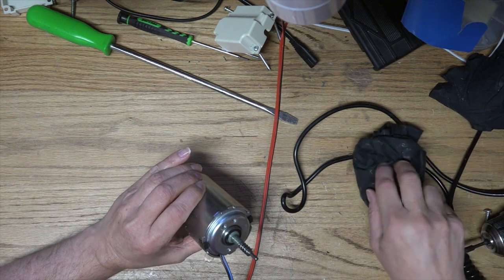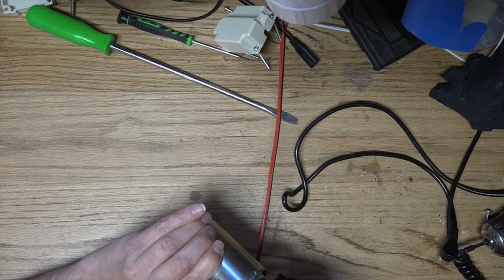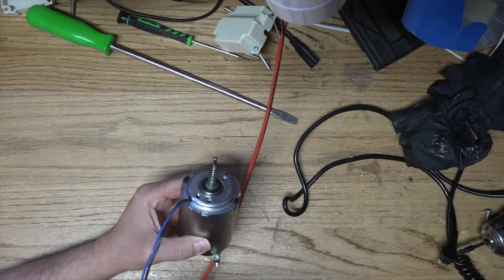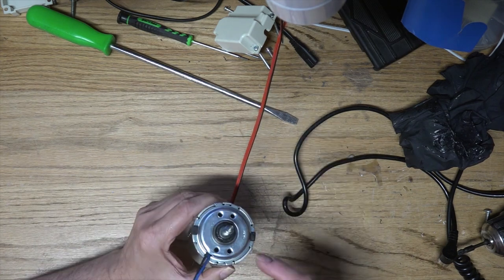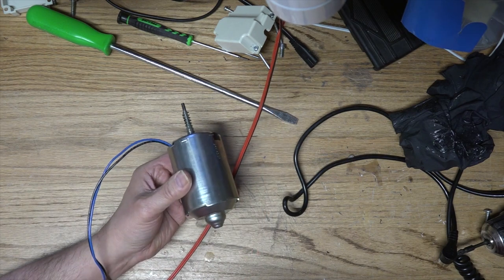It's going with 5 volts. And does it have, oh man. Yeah, that's got pretty good torque. I can stop it if I really push. Of course, this thing's all greased up, which doesn't help. But yeah, that's quite the powerful motor there.